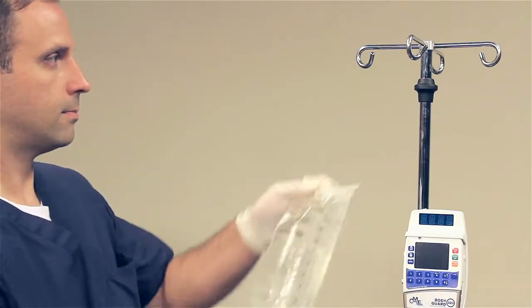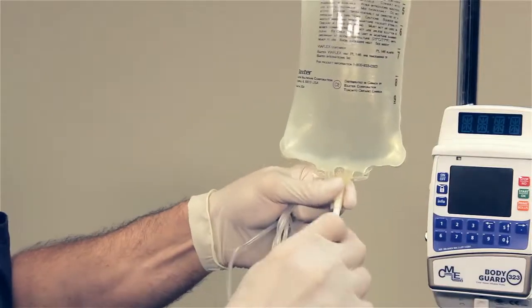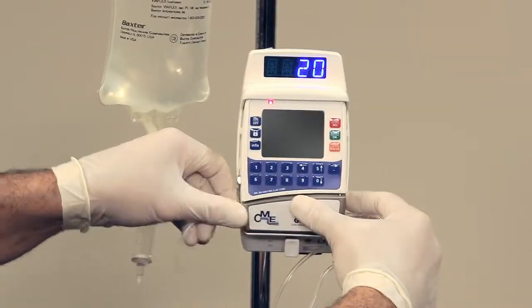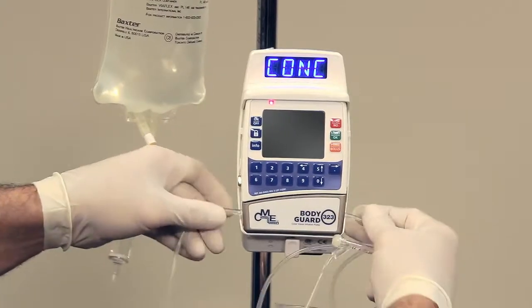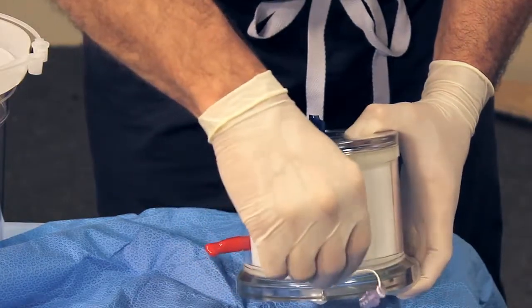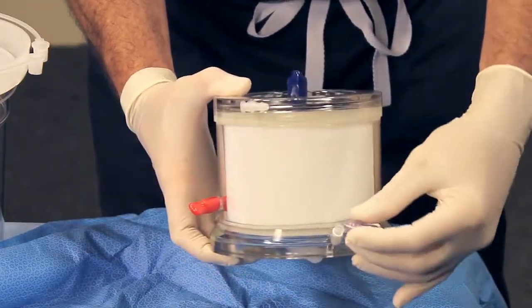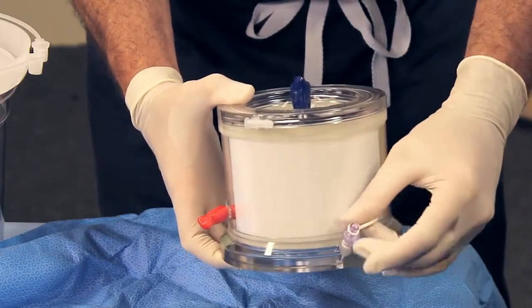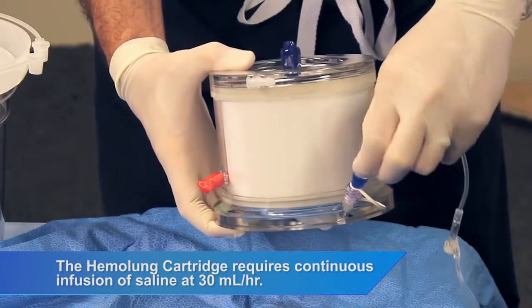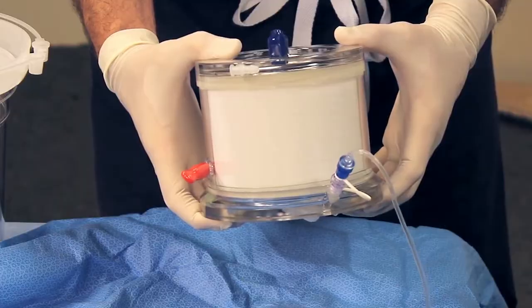Hang the seal flush saline on the side of the controller. Plug the spike in the bag 6 to 12 inches above the infusion pump. Prime the IV administration set and load it into the infusion pump. Connect the one-way valve to the seal flush port using a clean technique.